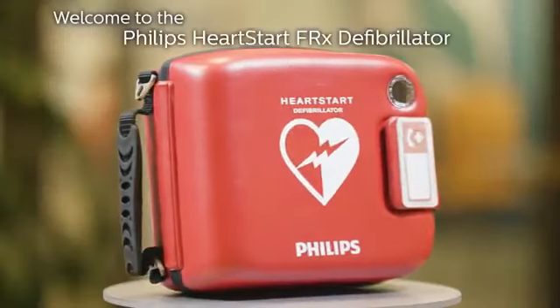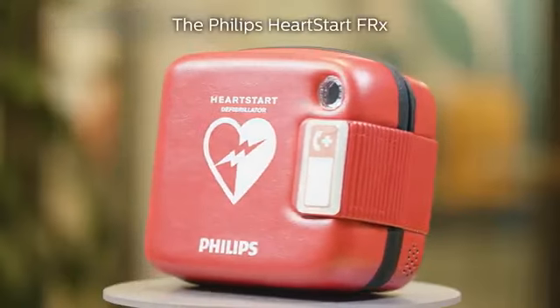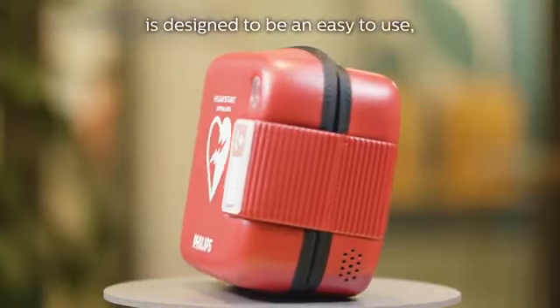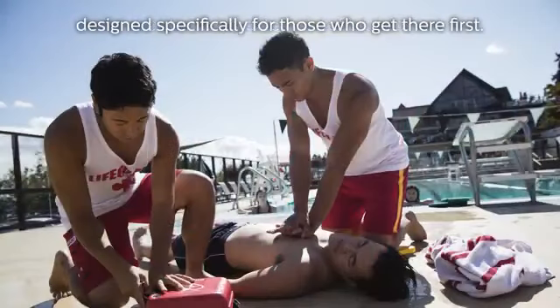Welcome to the Philips HeartStart FRX defibrillator demonstration. The Philips HeartStart FRX is designed to be an easy-to-use, rugged and reliable, automated external defibrillator designed specifically for those who get there first.